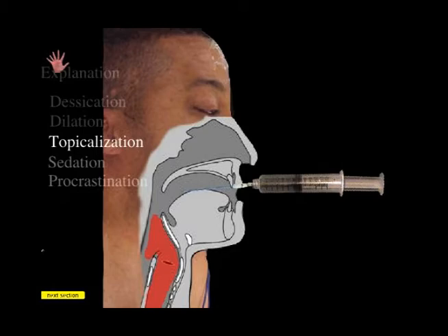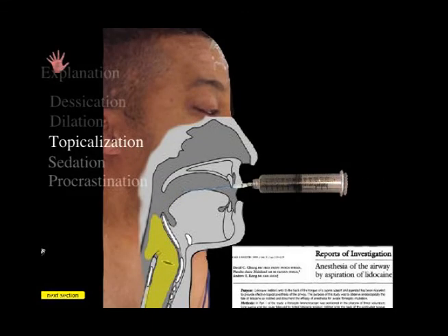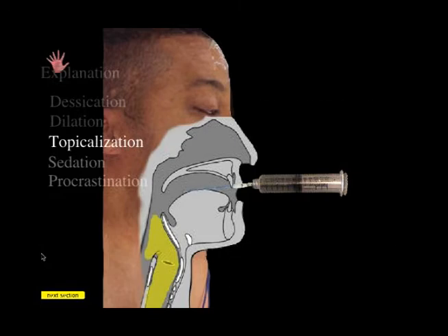It's a syringe with a plastic catheter. I'm going to hold that catheter up to this patient and say, this is not a needle, it's just a catheter. It's just a piece of plastic, and I'll show them it's floppy. And I'm going to drop that lidocaine on the very, very base of the tongue, let it drip down, and aspirate. Now, why is he aspirate?